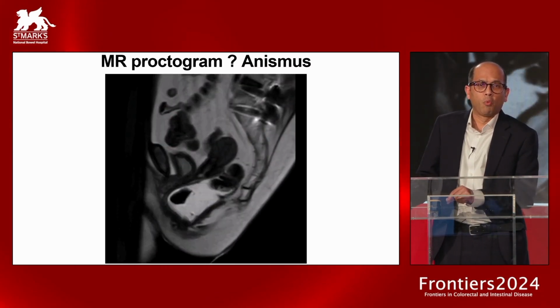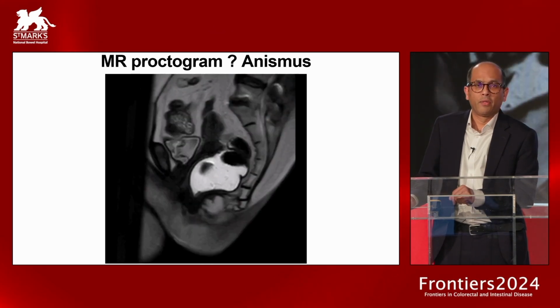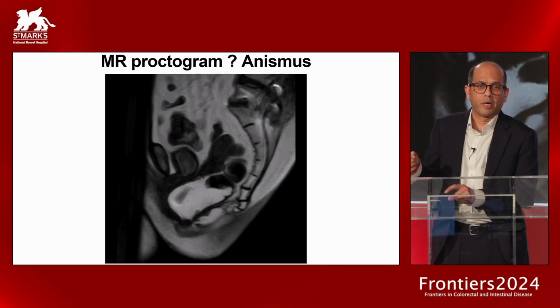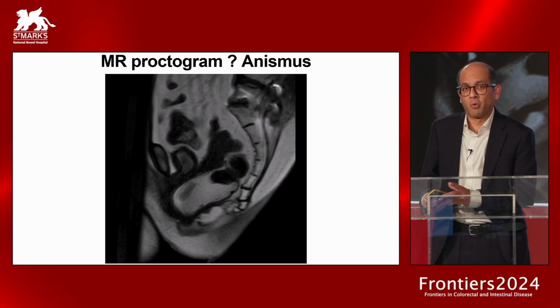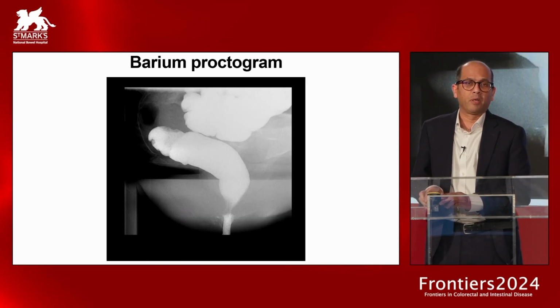segment. And what you can see is the typical picture that we often see. There's quite a lot of effort. The rectum and the pelvic floor are descending quite low, but it's bobbing up and down, and in the end, they weren't able to evacuate. So the impression given on that examination is that they potentially do have a problem with anismus, but for a few reasons.